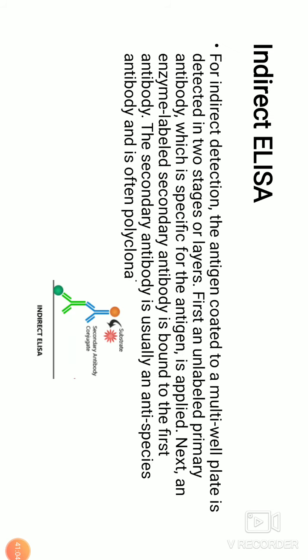So you have indirect ELISA, for which you have coated the antigen and you have the primary antibody elicited. To that primary antibody's Fc region, you have the secondary antibody, which has the enzyme attached to it. In this case, it's an advantage. Suppose you are raising the primary antibody in mouse, only one secondary antibody is enough to say that this indirect ELISA is working. The amount of color, fluorescence or luminescence reaction product that is formed is measured using a sophisticated plate reader and compared with the amount generated with the same set of reactions performed using standard antibody concentrations. Then you can quantitate your results.